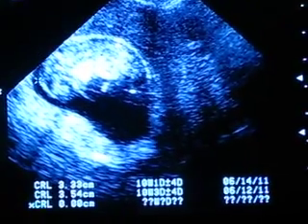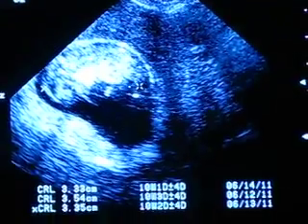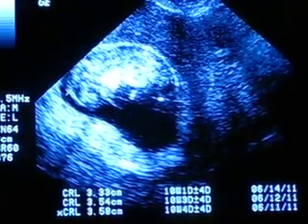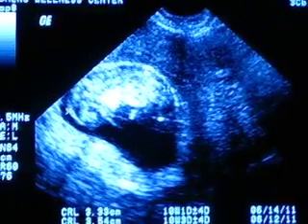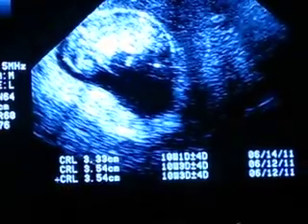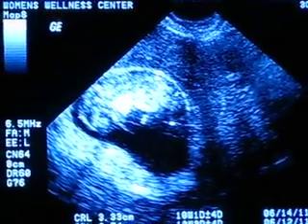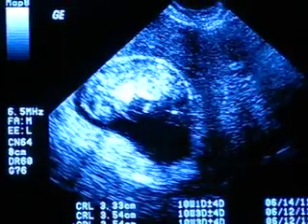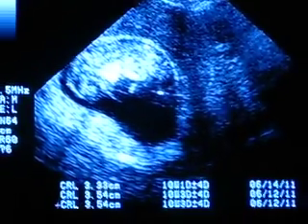What do you have at home? I have two boys and three girls. I'm guessing it's a girl by the heartbeat — it's about 170-ish. Now, that's total crap scientifically, just so you know. But it always works for me — it's been pretty accurate so far. There's no science behind it, but like the sun rises over there, it has to be a girl.